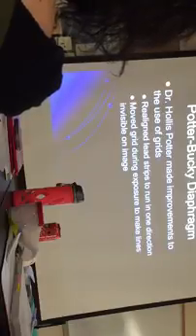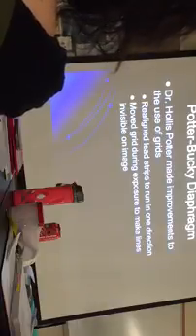Have you ever heard patients saying, oh, this thing shakes when you make exposures? They will, because that's what happens. It feels like an earthquake or whatever. But when you make the exposure, the table moves, and that's the Potter-Bucky grid moving. When it's moving, the lines disappear. You don't have those grid lines there anymore. Okay, they're gone.